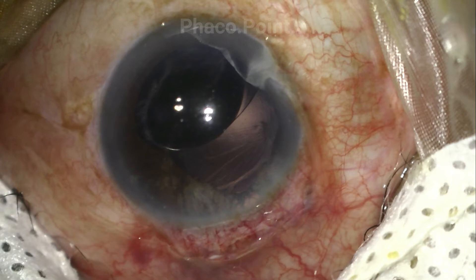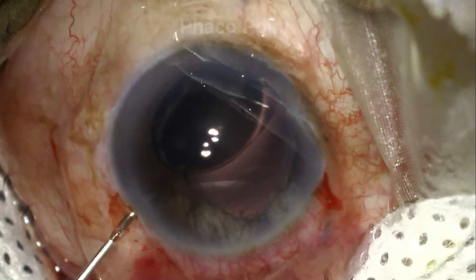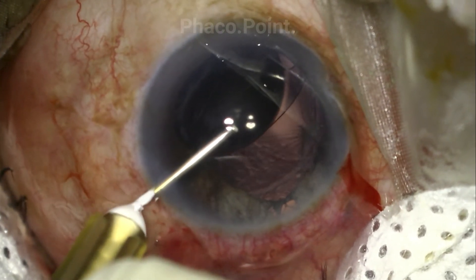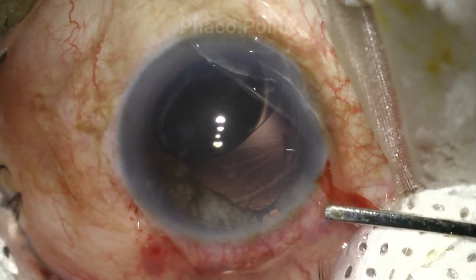A surgical plan was made to explant this IOL and replace it with a three-piece IOL in the sulcus. A new side port incision is created to give the surgeon maximum and comfortable access during the IOL explantation procedure. The globe is then insufflated with viscoelastic.